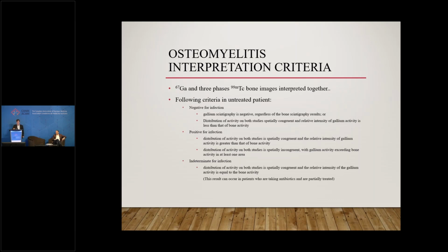Now, this is an important slide. This is the interpretation criteria for 3-phase bone scan and gallium imaging. And the main question is, is the bone infected, yes or no? We know the patient has infection. We want to know if there is osteomyelitis.